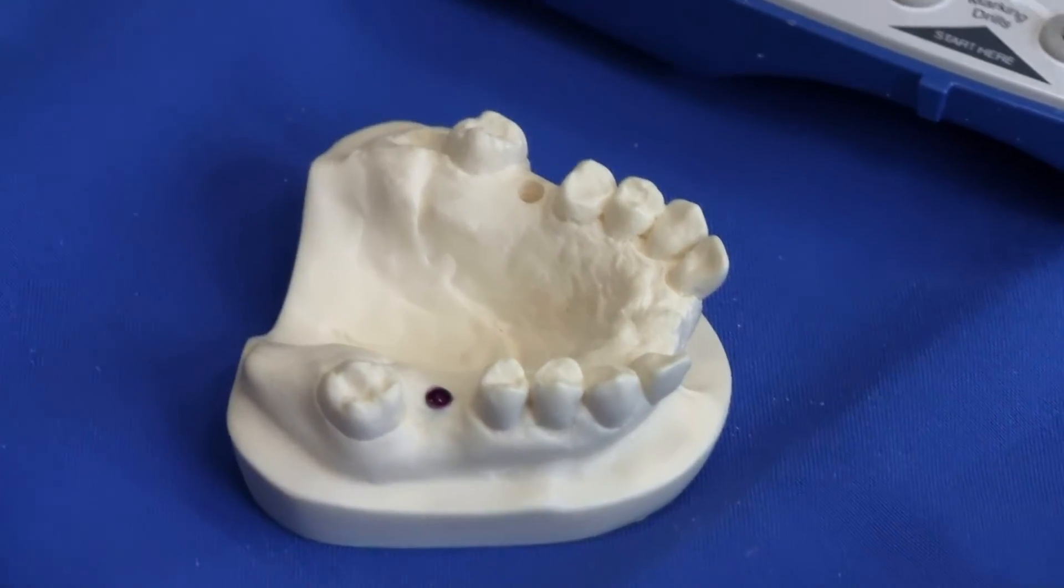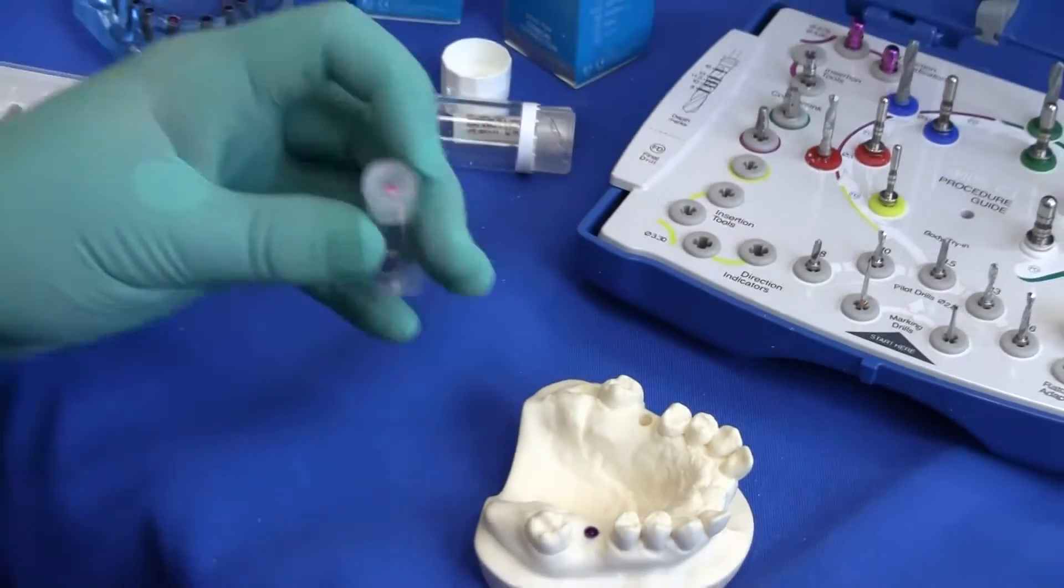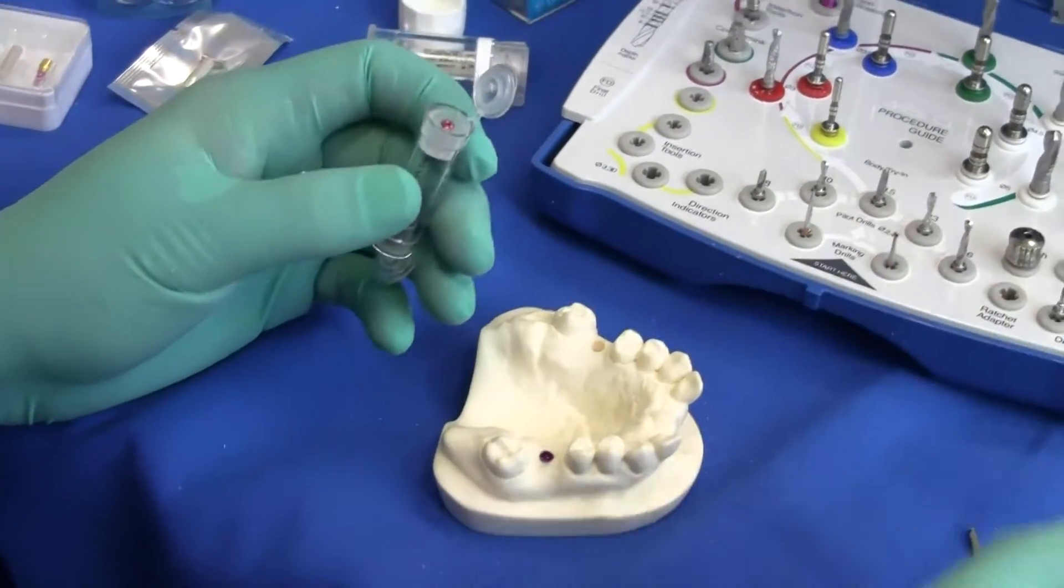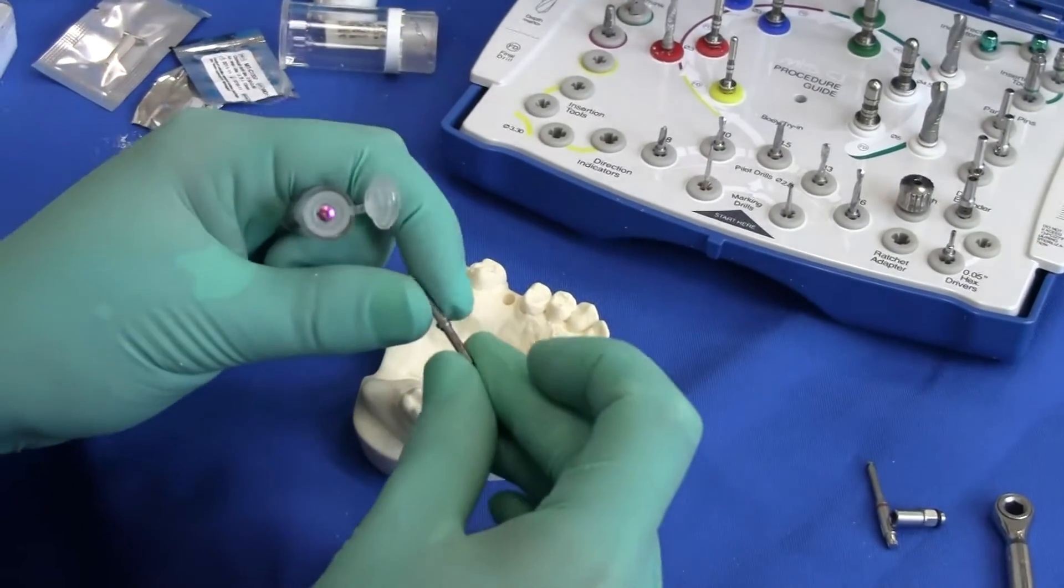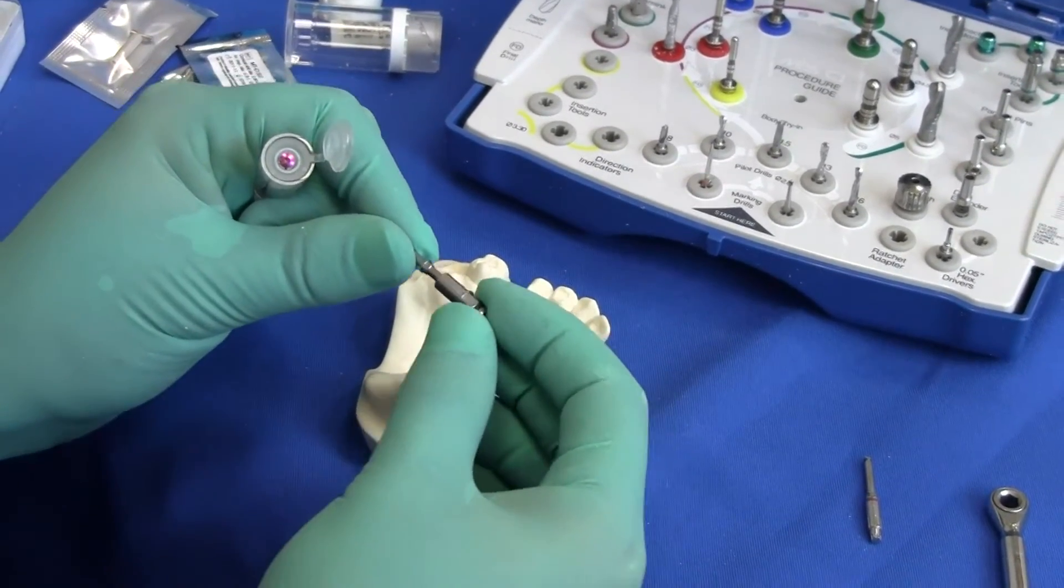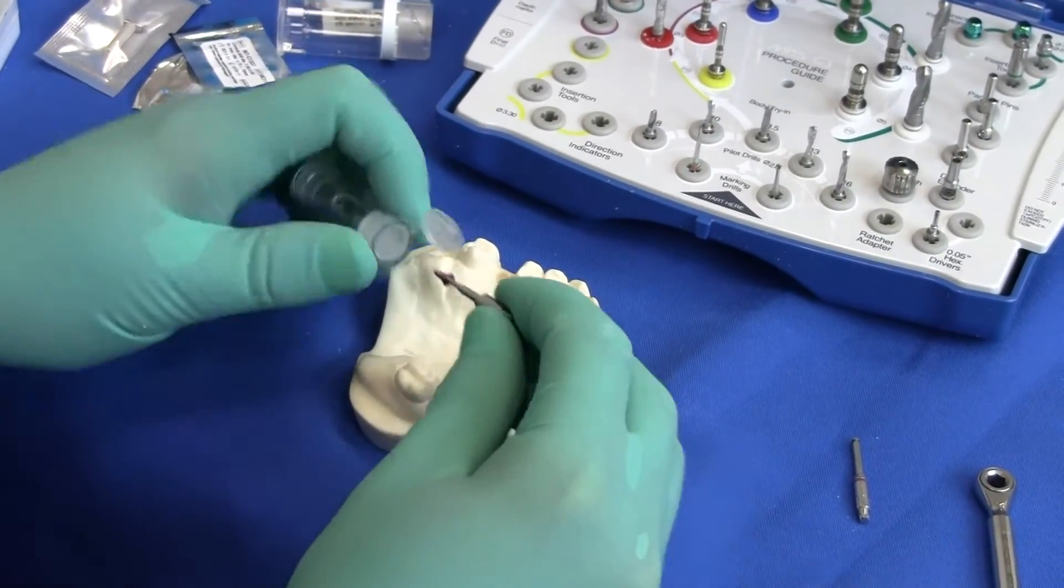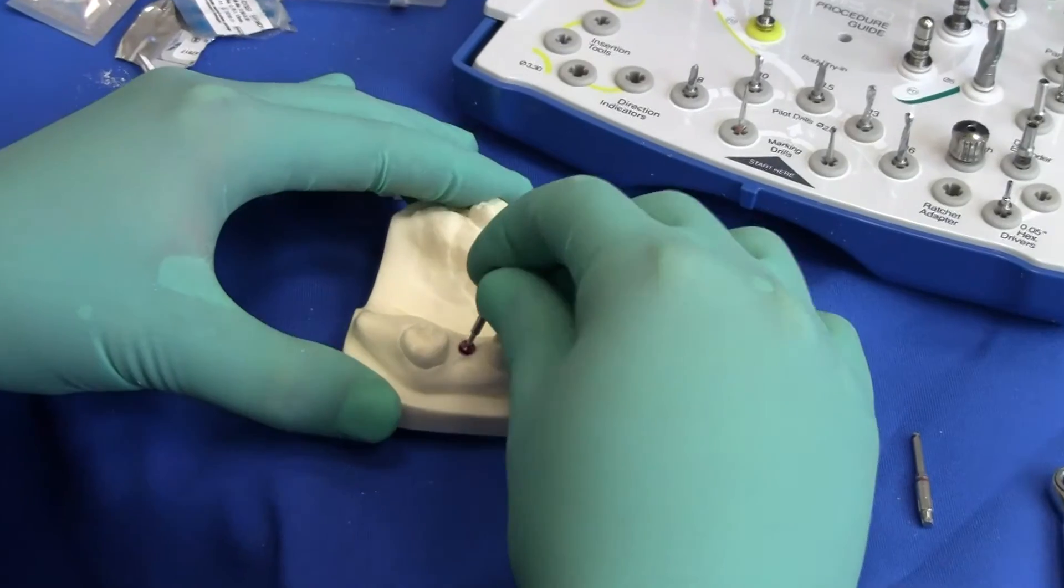Each C1 implant also comes with its own cover screw, color-coded as well. So you can either place that with our handpiece or using the same adapter with the wrench. Start placing it just like this.